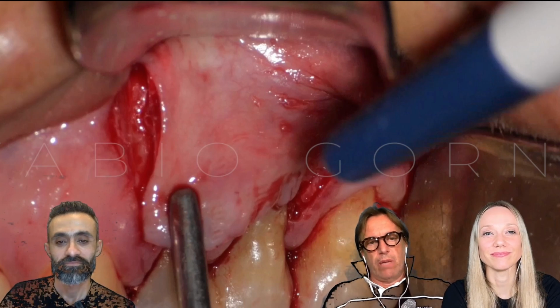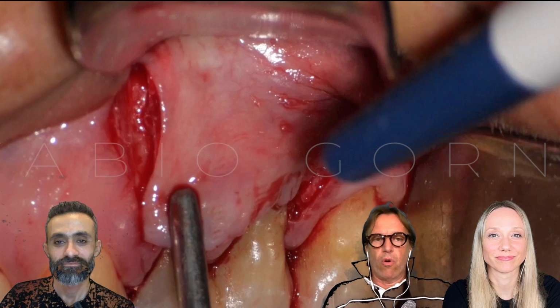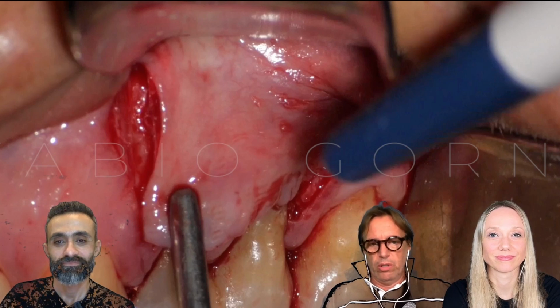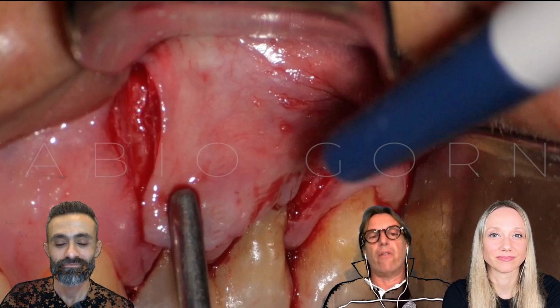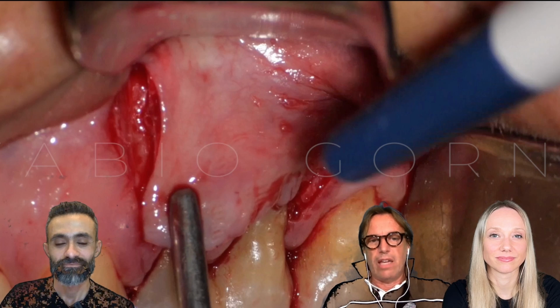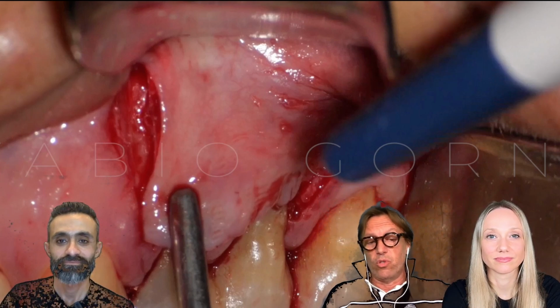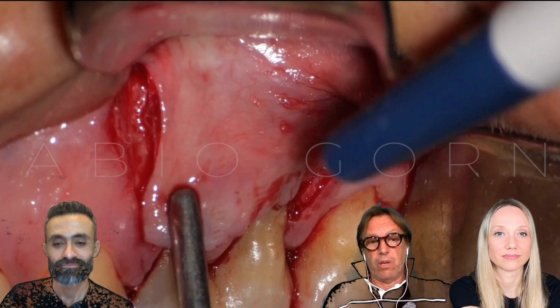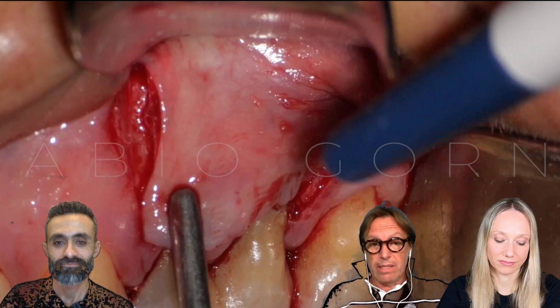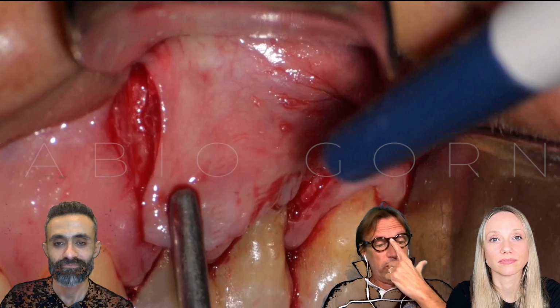and I'm trying all the time to follow the easiest way. Of course, if the results are not good, I will change it. But the results are very, very good without any differences in terms of success rate between the new material and the old material. I started many years ago using amalgam, and then I discarded amalgam completely because with the cements, we can obtain better results and all the procedures are simple.